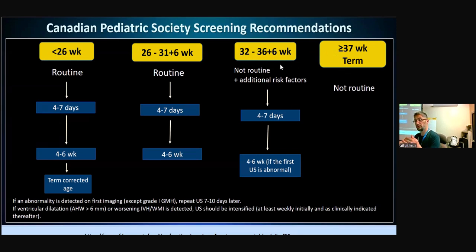Between 32 and 37, it's not routine, but if there are additional risk factors, you can do an ultrasound. Under 32, it's always recommended. And the timelines change, but here the most basic one is this one. In Canada, we scan less frequently. In Europe, they scan more frequently, but this is really basic.